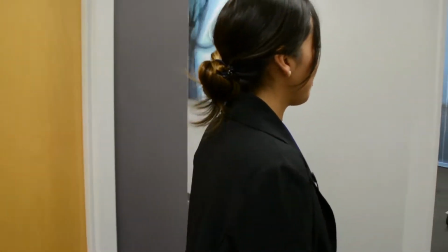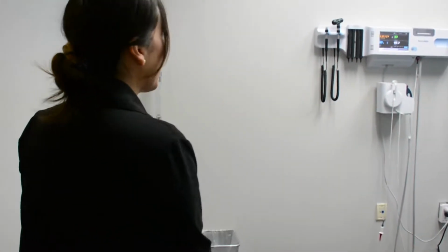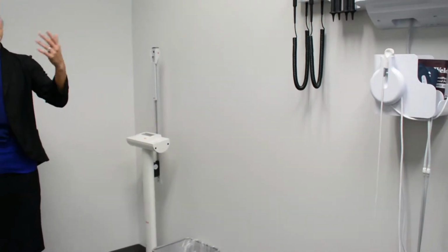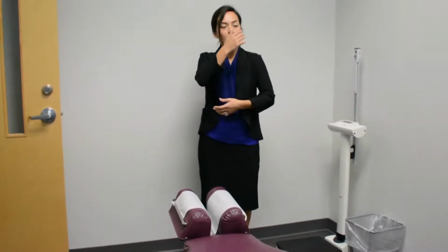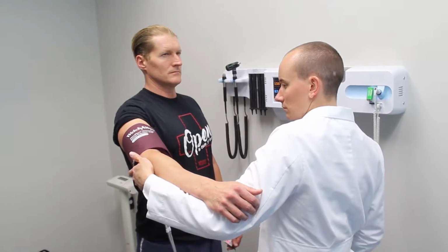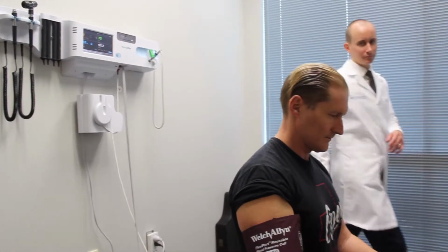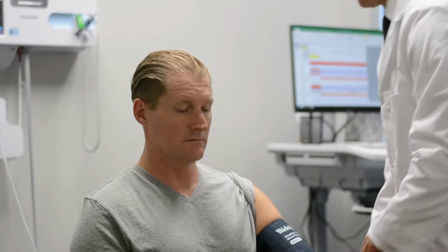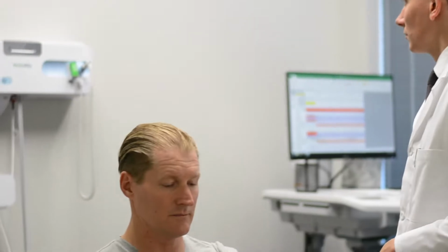The first of the rooms is our vitals room. So you're welcome to come on in. So the vitals room seems like just a regular room. We're going to take your height, your weight, your temperature, your blood pressure, but where you'll begin to see the differences is that we're not just taking your blood pressure, we're actually doing a full autonomic assessment, meaning that your blood pressure will be taken on both arms while you are sitting, standing, and laying down. They begin to look for these differences because if by any chance the blood pressure differs from one side to the other, that actually could be associated to brain functionality right and left. So it's a very, very thorough autonomic assessment.